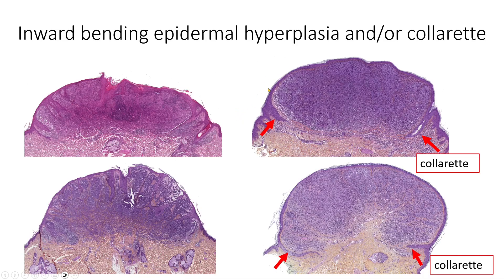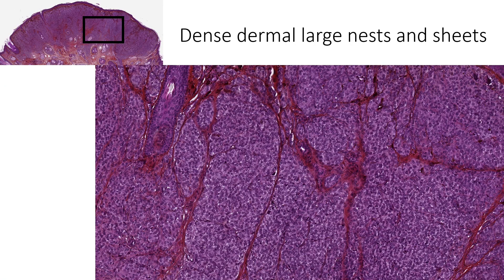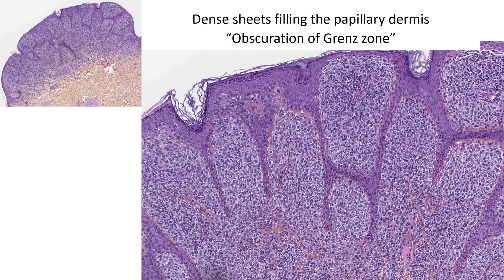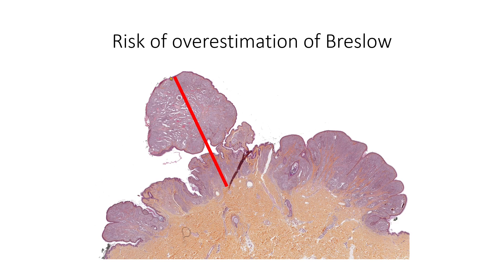Here are some illustrations of the border of the lesion. We can have this collarette of epidermis on both sides. A key element to the diagnosis is the high density of the dermal component with large nests or sheets of cells. This high density can even fill the grenz zone in many areas. When the papillomatous component is important, there is a risk of overestimation of the Breslow thickness.